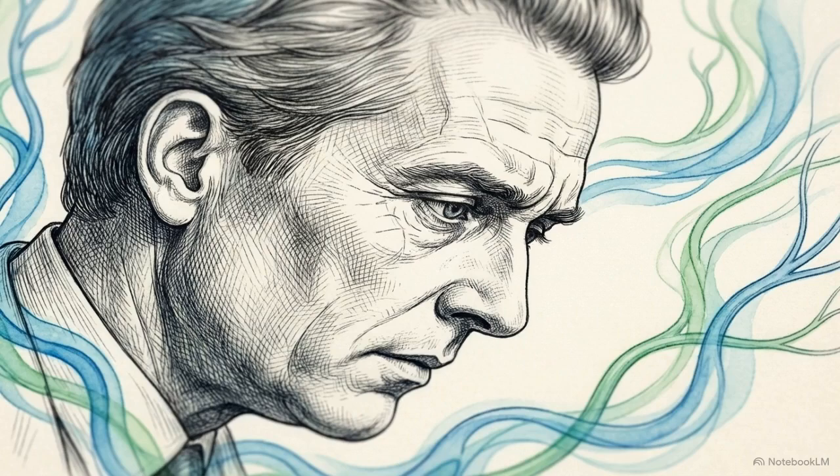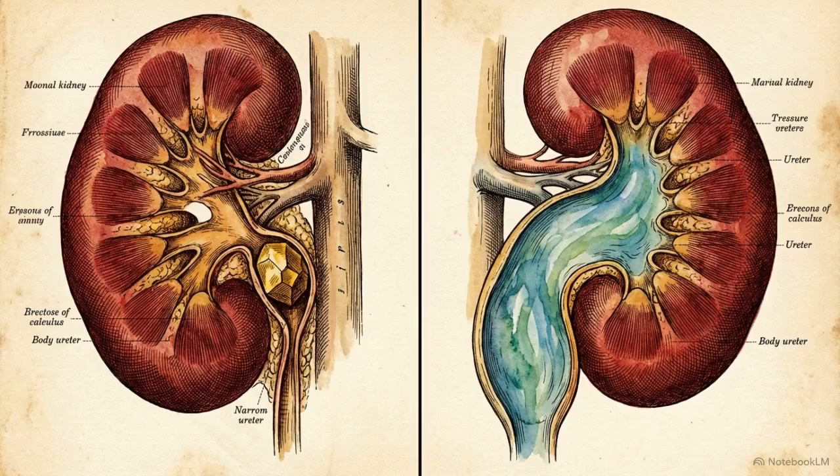When clearance is delayed, the immediate diagnostic problem is figuring out if the collecting system is physically obstructed by a blockage or simply dilated and sluggish.